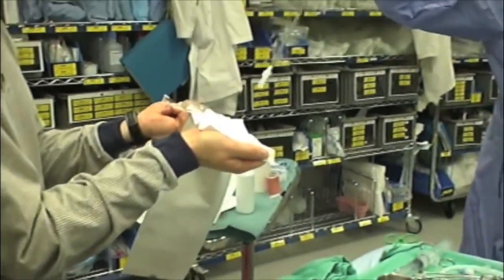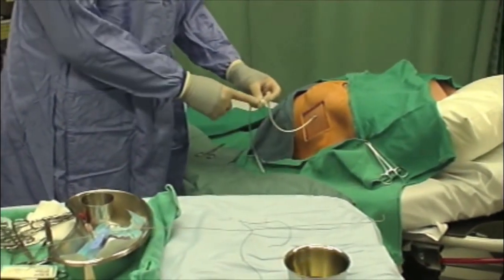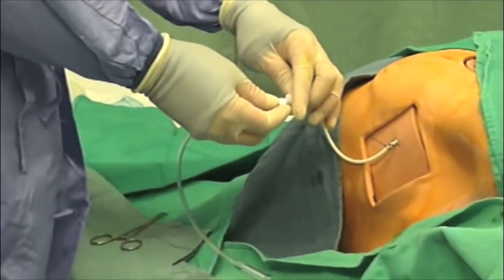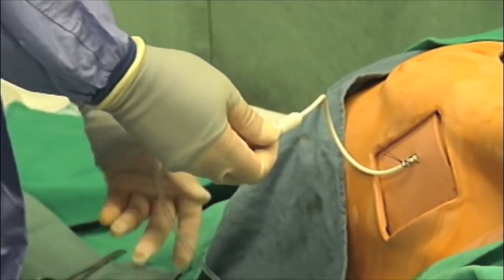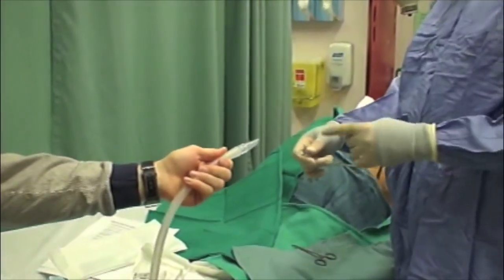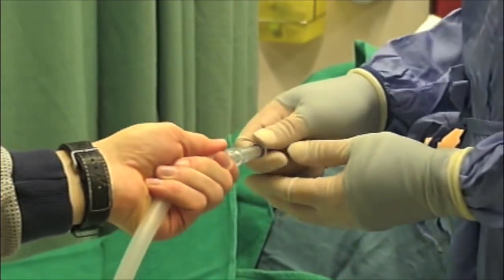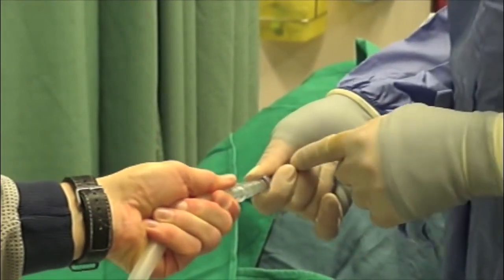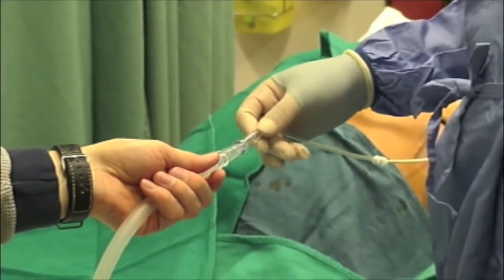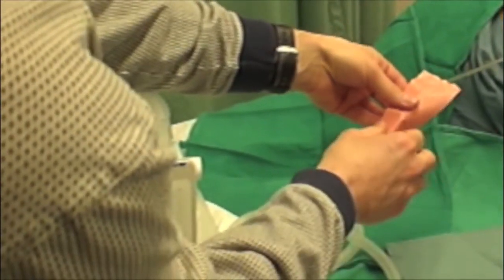Have an assistant open the connecting tube. Attach the connecting tube to the pigtail. Attach the connecting tube to an underwater seal apparatus, the Pleurovac. Apply waterproof tape to the connection.